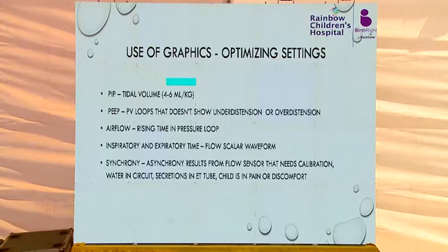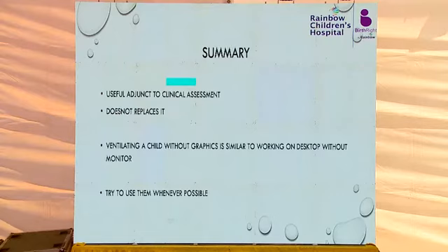Also, asynchrony results from a flow sensor that needs calibration, water in the circuit, secretions in the tube, or the child being in pain or discomfort, and you take care of that.